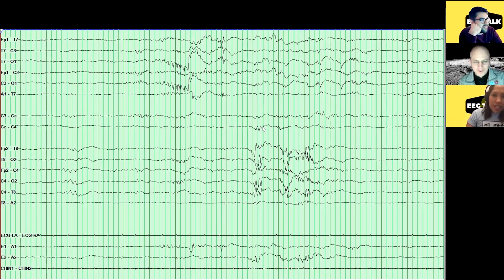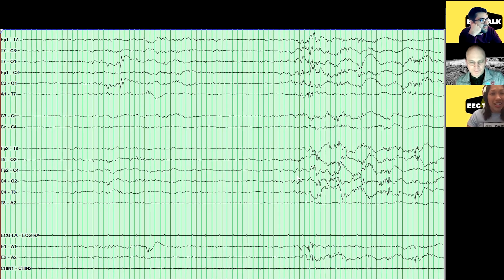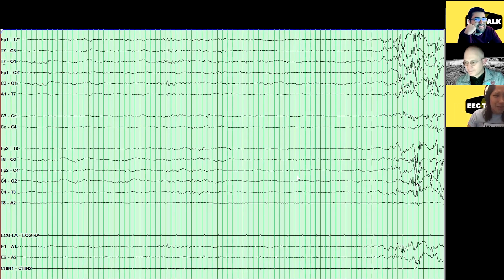And sometimes the bursts are synchronous and sometimes they're a little asymmetric with one side starting before the other. Once again, that's also normal for this baby's age range. And we'll get into how you know what's normal and what's not. You can memorize it all or I'll show you some cheat sheets.